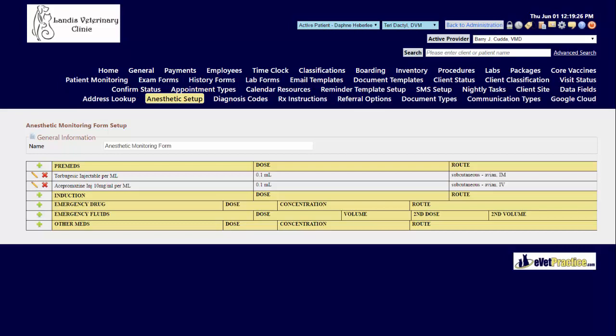Typically pre-meds and induction drugs are filled out before the surgery takes place so that the form is not designed to calculate these doses for you.